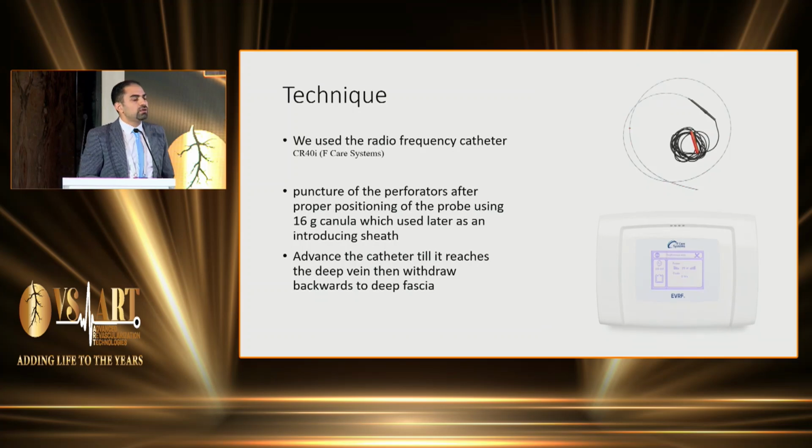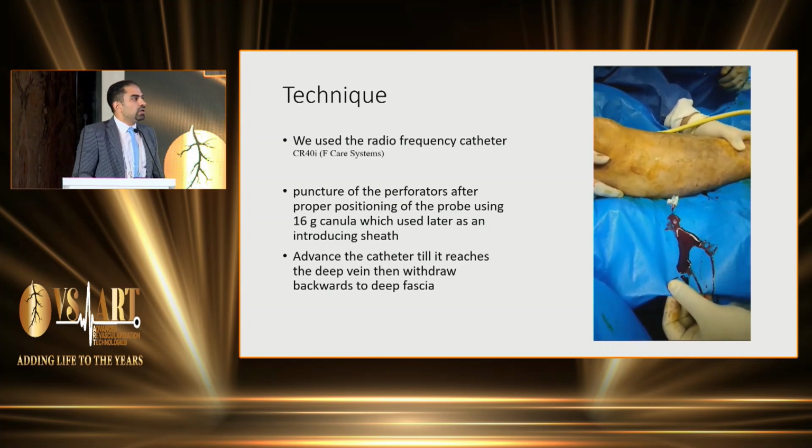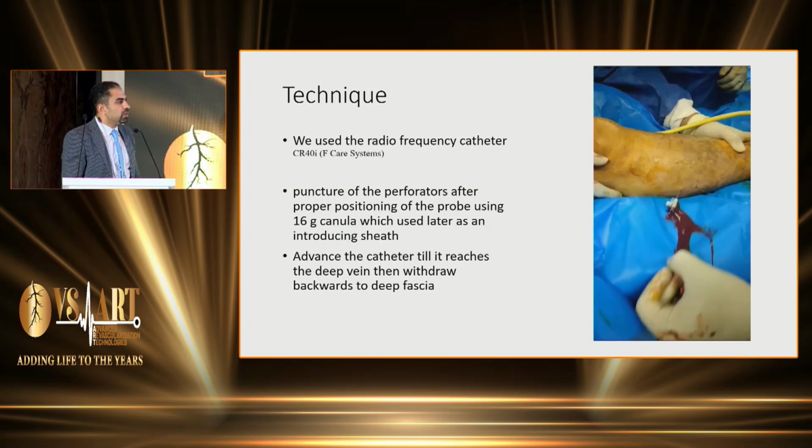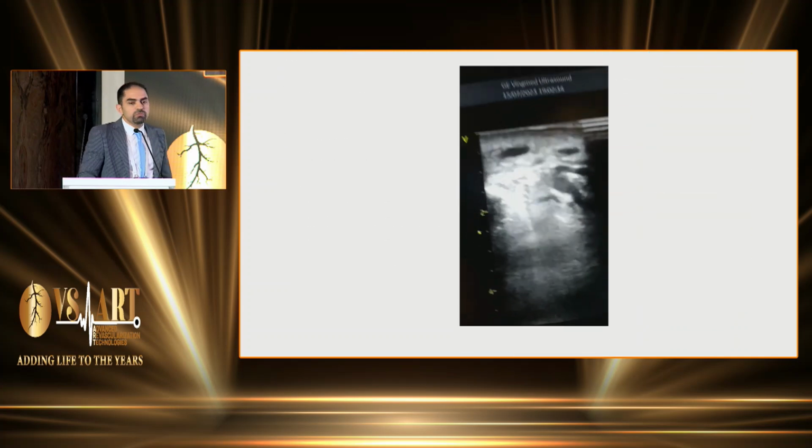We used the radiofrequency catheter and punctured the perforators after proper positioning of the probe, making a longitudinal section and puncturing the perforators, like in this video, until we reach the perforators and ensure proper positioning by duplex.